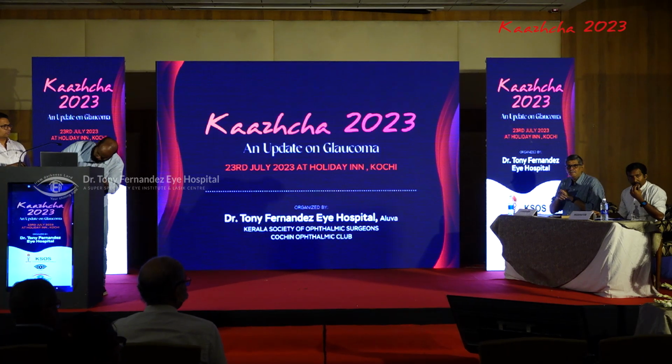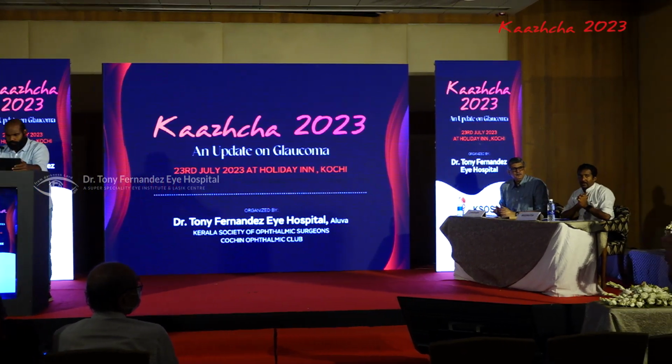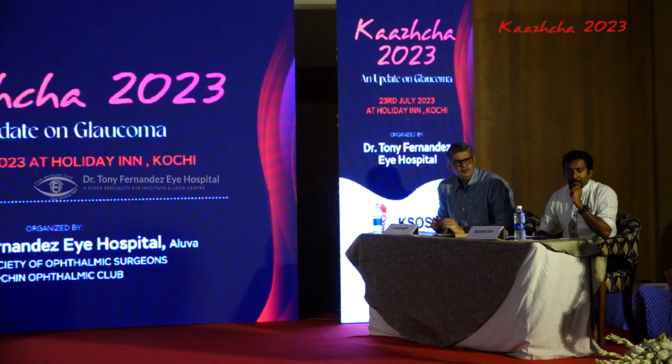For a diurnal variation, firstly I would do it most of the time in office hours. So typically we ask the patient to come in by 9 o'clock earliest, and take 2-hourly readings through the clinic hours. Sometimes I take it till 7 o'clock because the clinic is open till 8. Typically till 5 o'clock is what we take. And the second question is, when would you do it?